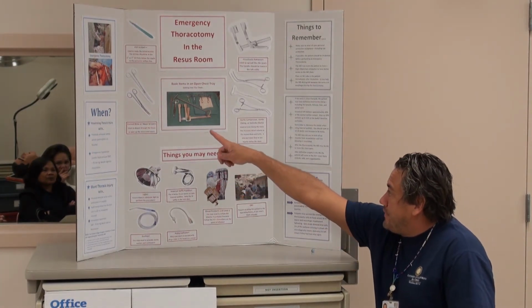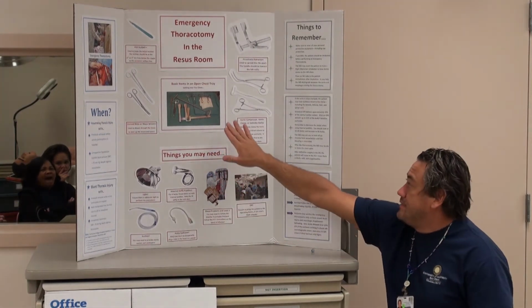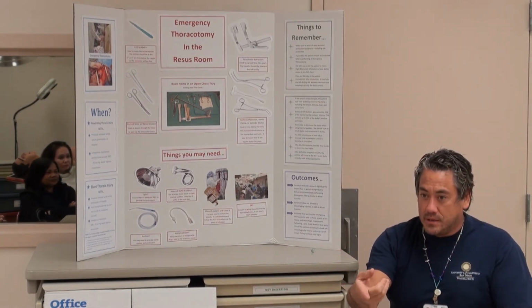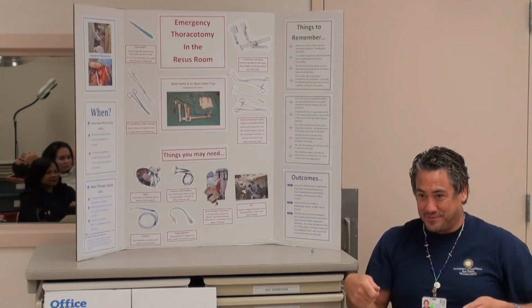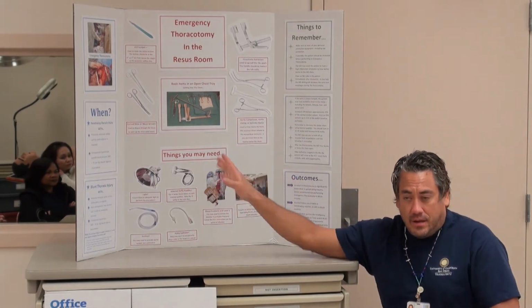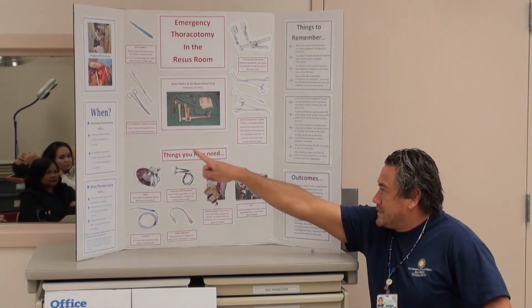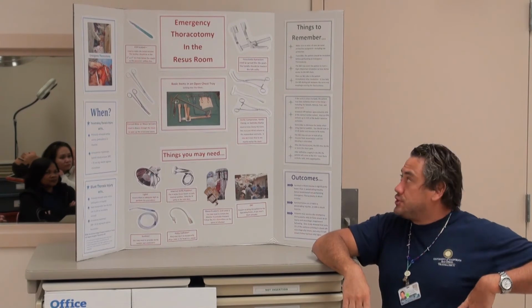So they'll open it up, and then there are these Metzenbaum or Mayo scissors that will be in the kit, and this is the top layer. It's almost like boxes in different layers, and this kit is made of different layers too. So the top layer is just the access layer. These are towel clips to make your field. You'll have the scissors to go through the tissue and separate the tissue out.